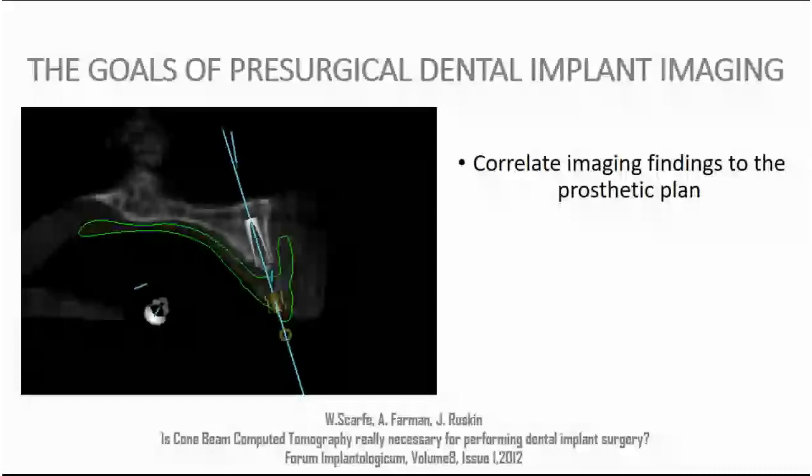Sometimes we go to the implant procedure, we see that there is available bone, we place implants, but then afterward we encounter problems because we do not have proper prosthetic elements. Maybe we will impair some space which is necessary so the patient could speak properly, or we will impair some aesthetic elements of the prosthetic reconstruction.